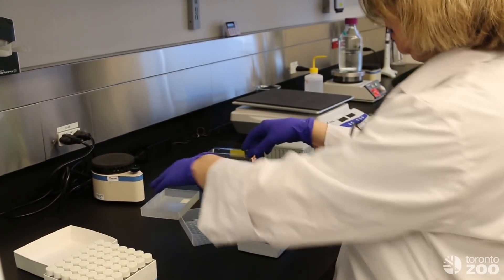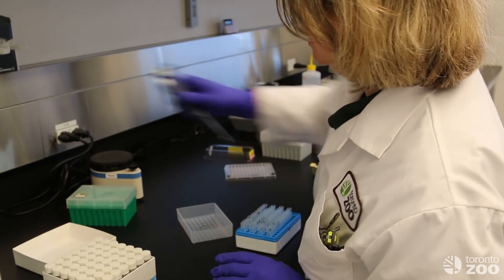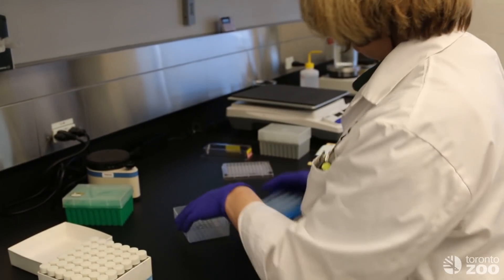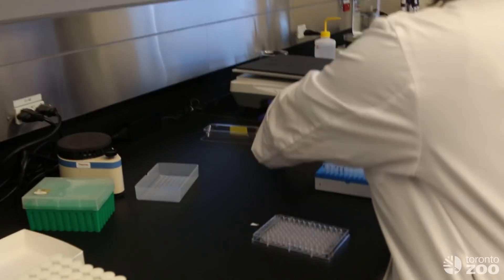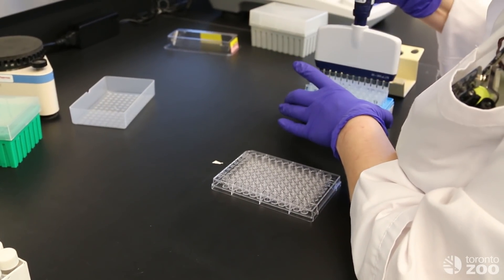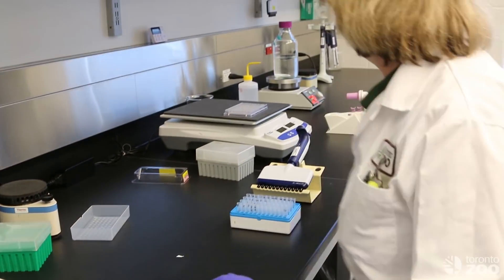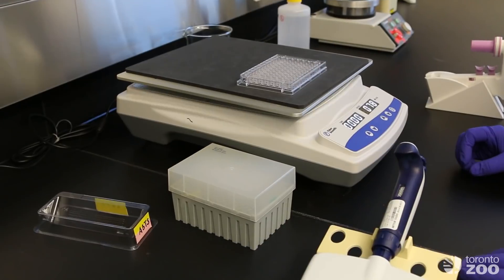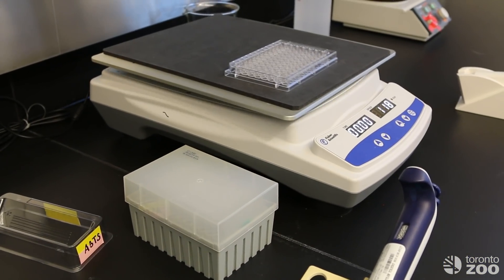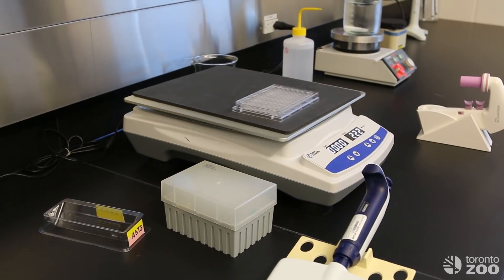Once all of Mestari's samples have been diluted we then have to load them on the plate. Once all of her samples have been loaded we would let them sit and incubate, which would happen for a couple of hours.